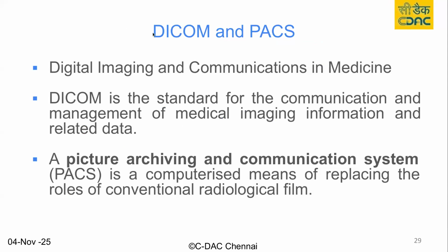As I said, DICOM is a digital standard, Digital Imaging and Communications in Medicine, which is a standard for representing medical imaging in the healthcare sector. So, most of the current X-ray machines use a picture archiving and communication system. It is a computer means of replacing the roles of conventional radiological films.